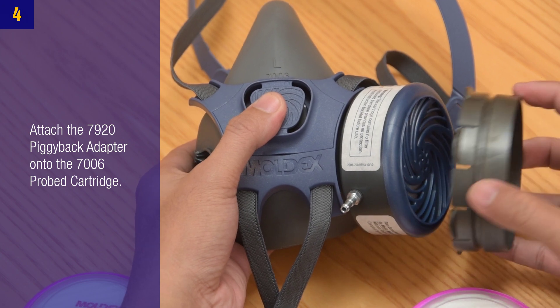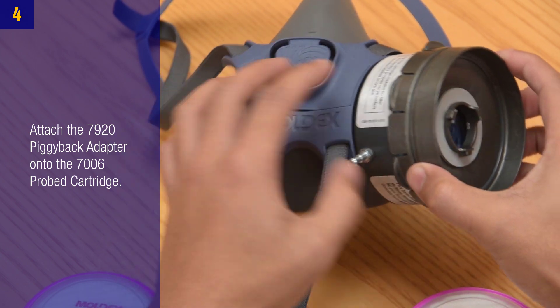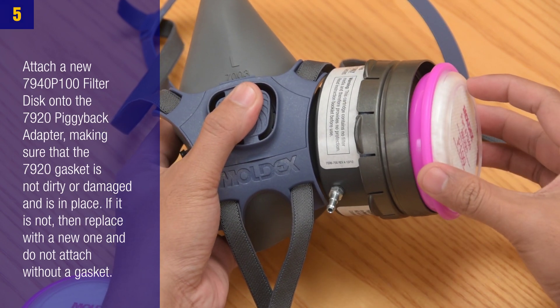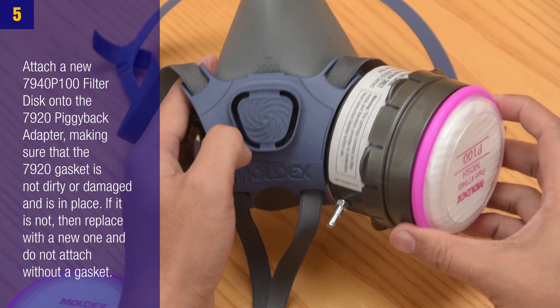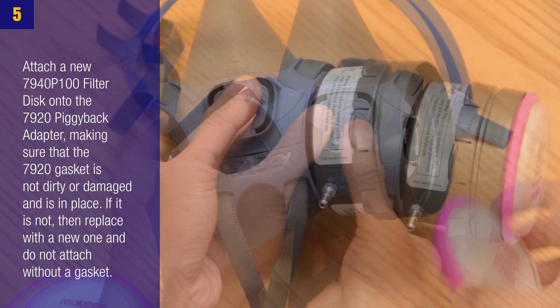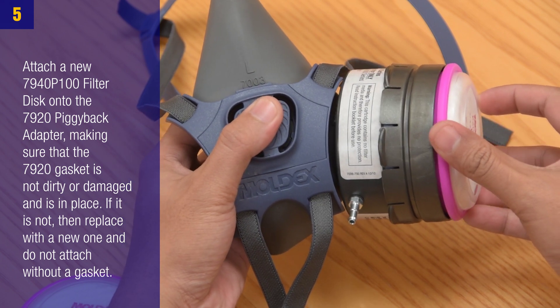Step 4: Attach the 7920 Piggyback Adapter onto the 7006 Probed Cartridge. Step 5: Attach a new 7940 P100 Filter Disc onto the 7920 Piggyback Adapter, making sure that the 7920 gasket is not dirty or damaged and is in place. If it is not, replace with a new one and do not attach without a gasket.